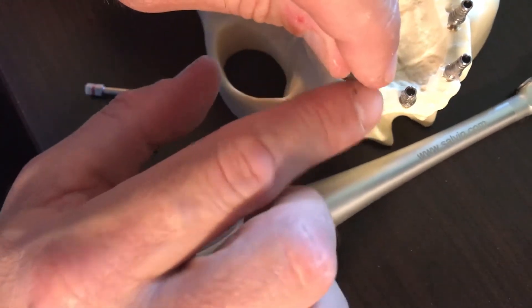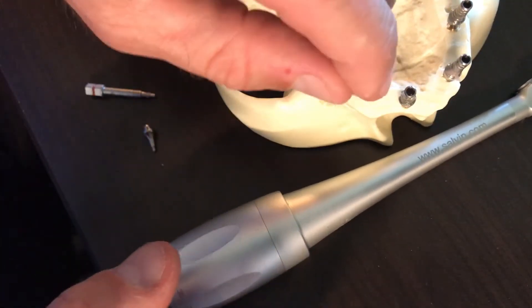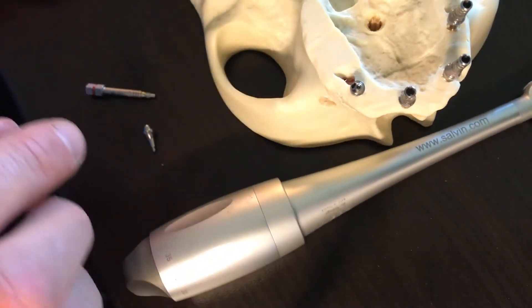In this case, it's a 30-degree abutment, and it helps me line it up parallel to the other pins. Now I'm going to switch over to a non-engaging abutment.